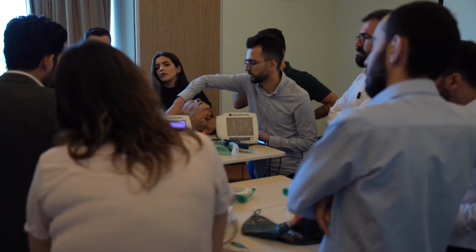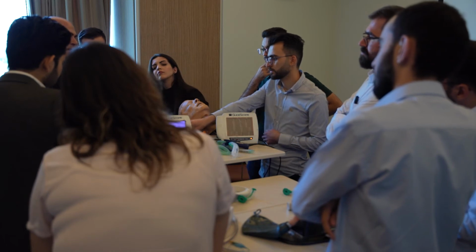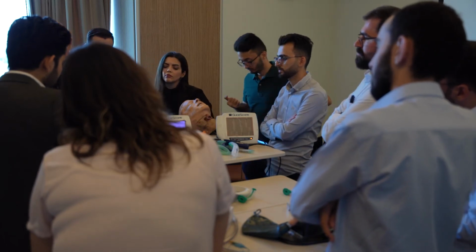This is for more obese and more soft tissue, okay? And this is for child, pediatric age group up to 40 kilograms. Good. Now this is 2 samples. You are going to fix this hole, which is fitted for this drill. You are going to just make like that. Let us choose which type.